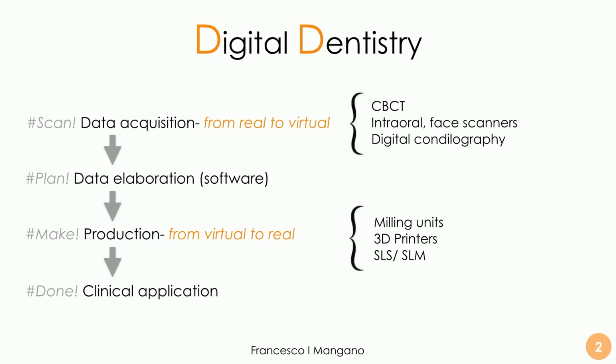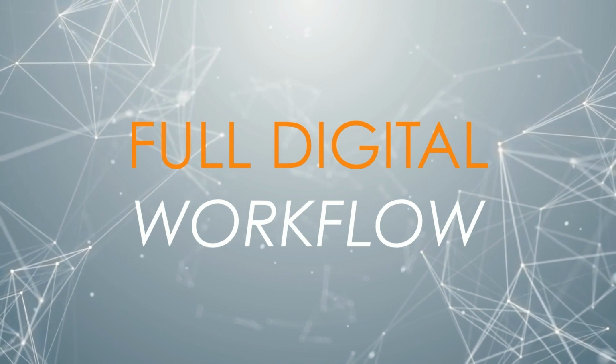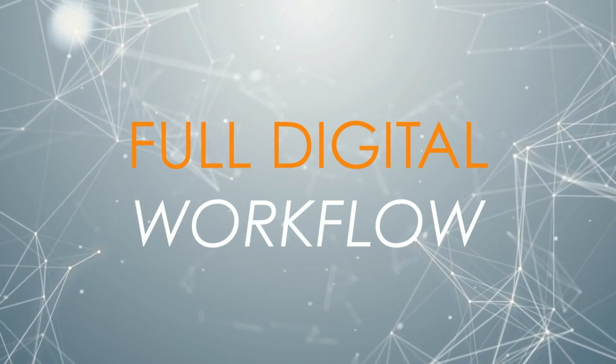And we have seen several cases, several applications already, but now we'll see in these 10 last videos more clinical cases. And let's talk a little bit about the full digital workflow as I work with in my little clinic on the Lake of Como.